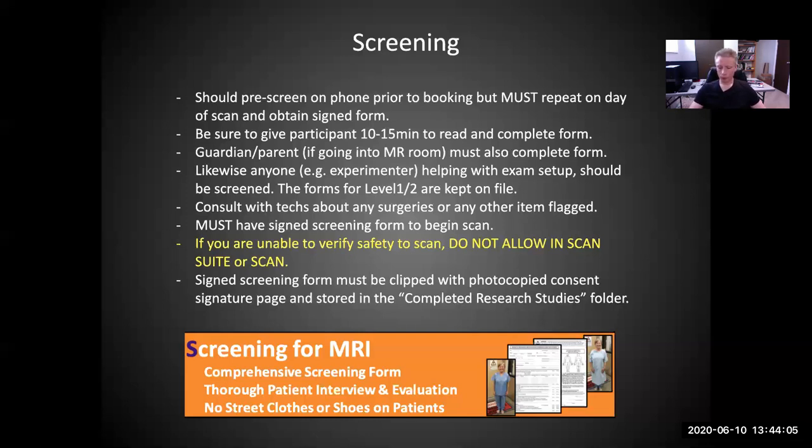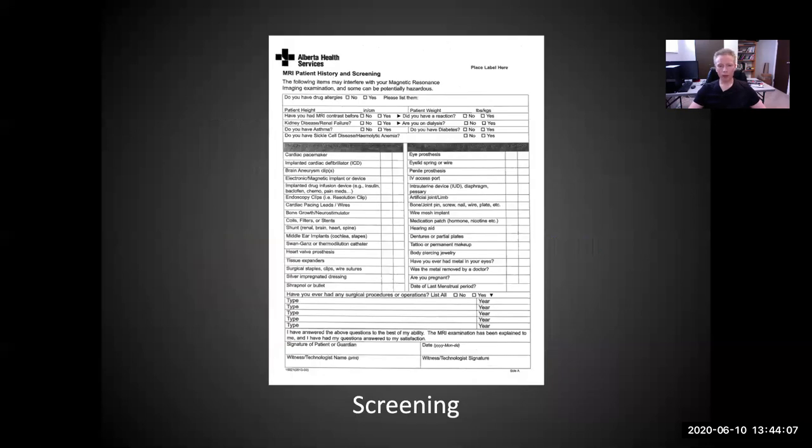Okay, so what does the screening form look like? The screening form is not something that we come up with. This is something that has been devised and approved by Alberta Health Services, and therefore, though it may not be exactly appropriate for most of our research studies, we still use it because this is the one that they've approved for use within the hospital.